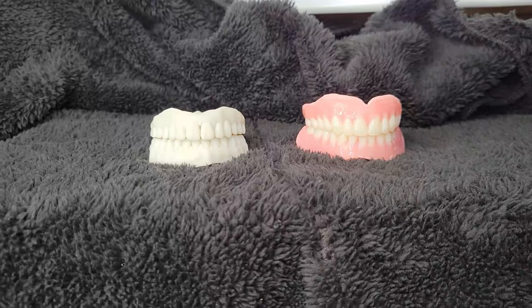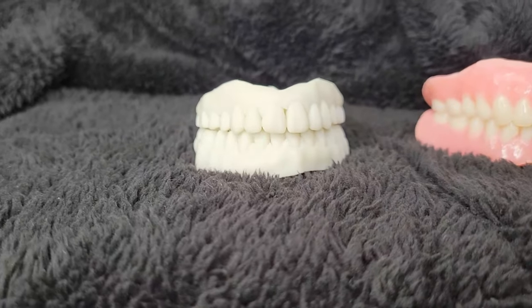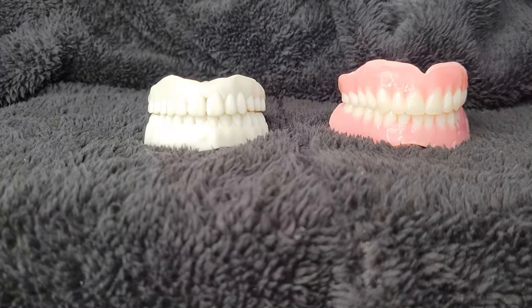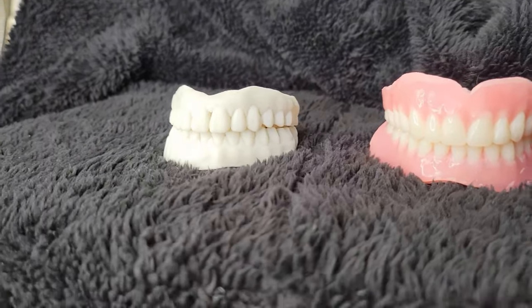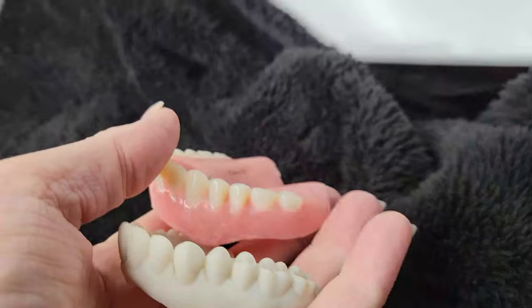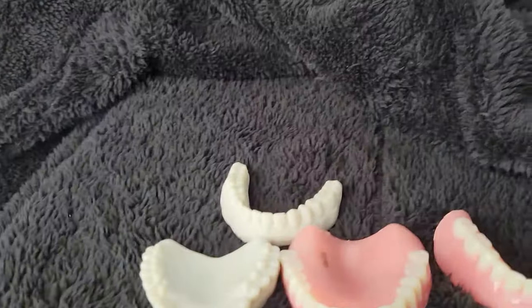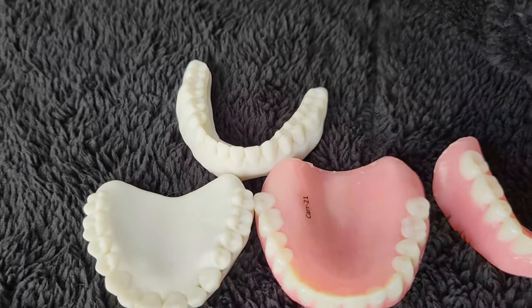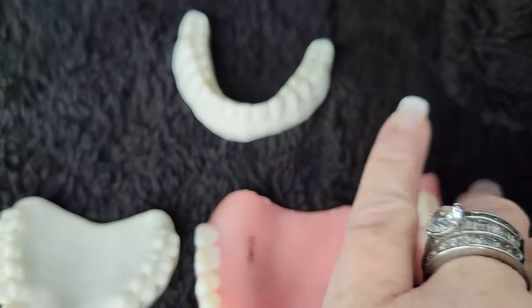Look at the size comparison of them. I've been wearing these all day. And the gums are really, really comfortable. I'm going to put them in for you and show them to you in a minute. But just the size — look at that. They're so much more comfortable.